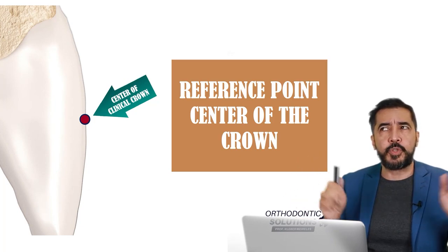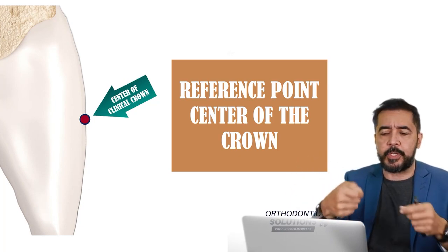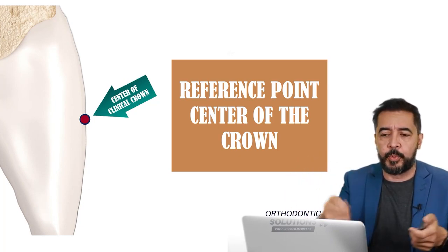Kleber, are you not going to use the positioning device to put the bracket?